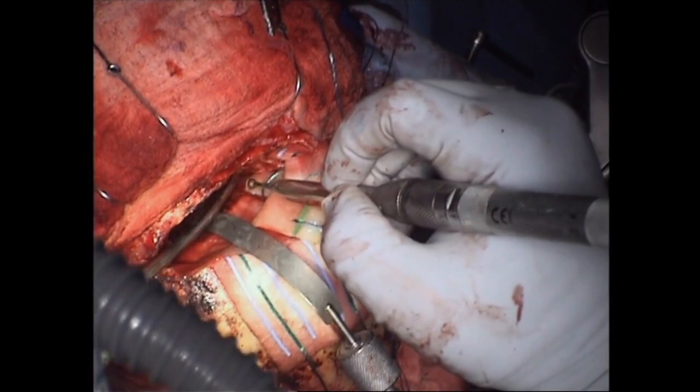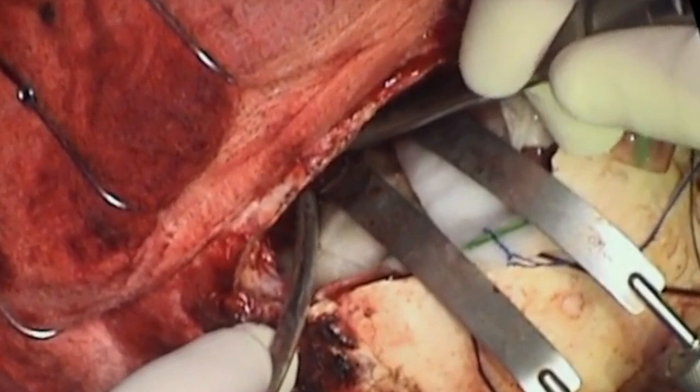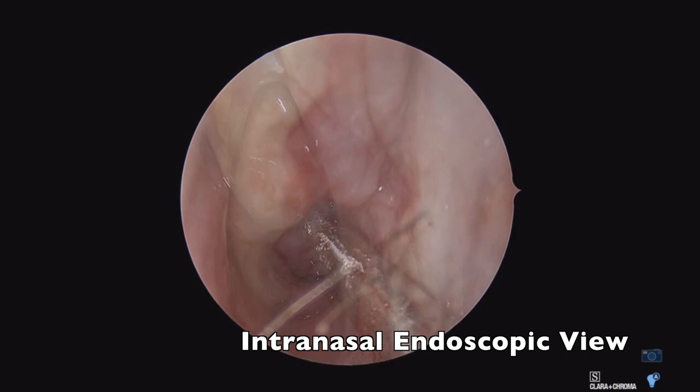It's very important that the entirety of the mucosa of the frontal sinus is completely removed to reduce the risk of postoperative mucocele formation or infectious etiologies. We sampled that mucosa as well, and much of that frontal mucosa was involved with tumor all the way up to the apex of the frontal sinus, which was nicely accessed through our open bifrontal craniotomy.